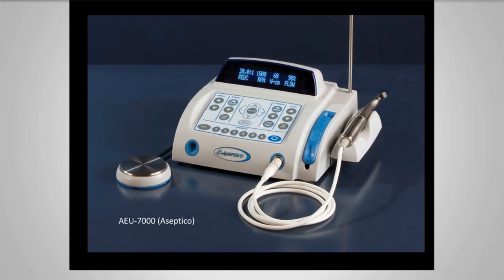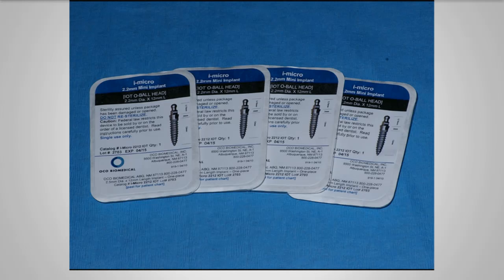Using the AEU 7000 from Aseptico, we went ahead and went to depth with the pilot drill. We utilized the 20-to-1 reduction handpiece at about 1800 RPM with a flow of surgical saline of about 90%. One thing that I like to do is I will refrigerate the 250 mils of saline before use. And so not only are we using irrigation, but we're using a cooler irrigation.